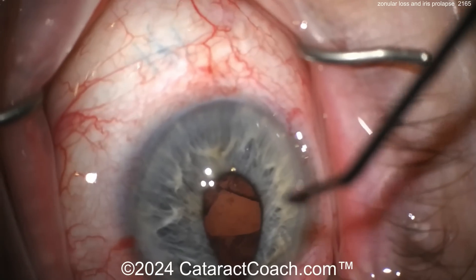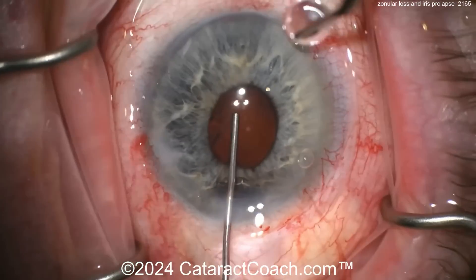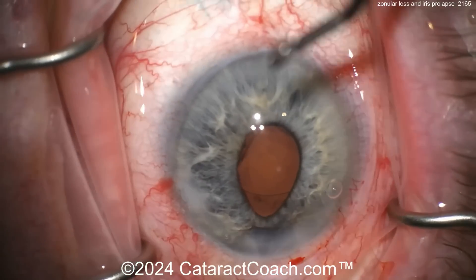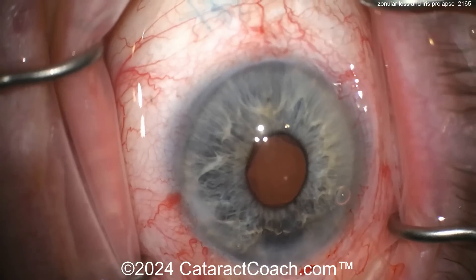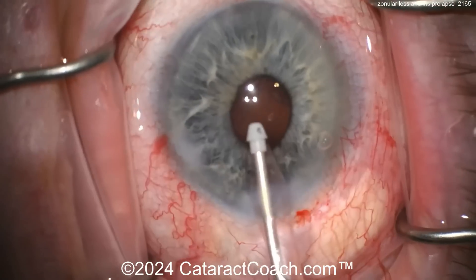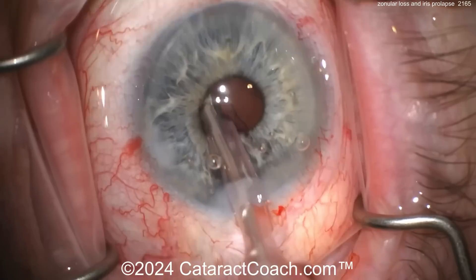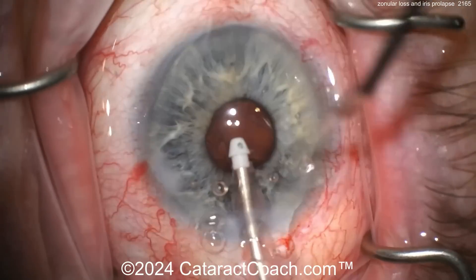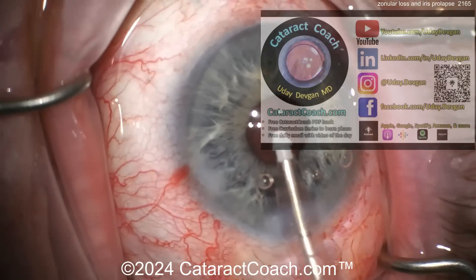Look at the iris again — now it looks like there's some zonulopathy there. Let's look carefully. Viscoelastic going in. There's still some cortex there to the left of the incision — I saw a big hunk right there. You kind of want to get that out. There's going to be all kinds of cortex remaining. I think you may want to use that second instrument, maybe put some hooks in. We've got to get a better view here.